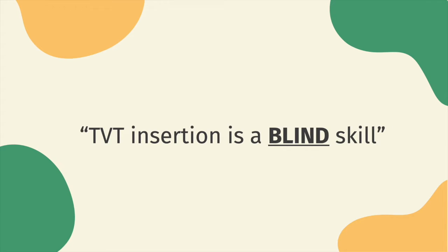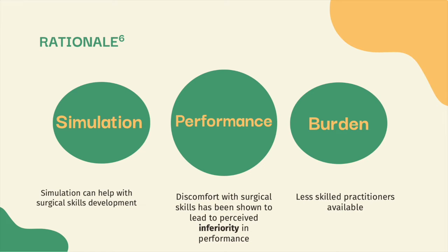The importance of proper movement of the TVT insertion trocar is essential, as this is a blind skill. Preceptors watching cannot see the path of the trocar, and learners may not be familiar with the path the trocar is supposed to take. This can create heightened anxiety and discomfort for both the preceptor and learner. We know from an abundance of literature that simulation can help with surgical skills. Also, discomfort with surgical skills has been shown to be associated with perceived inferiority in performance, resulting in less confidence in the skill. Practitioners therefore may not offer this skill to patients, placing the burden on those patients waiting for the surgery for specifically trained surgeons.